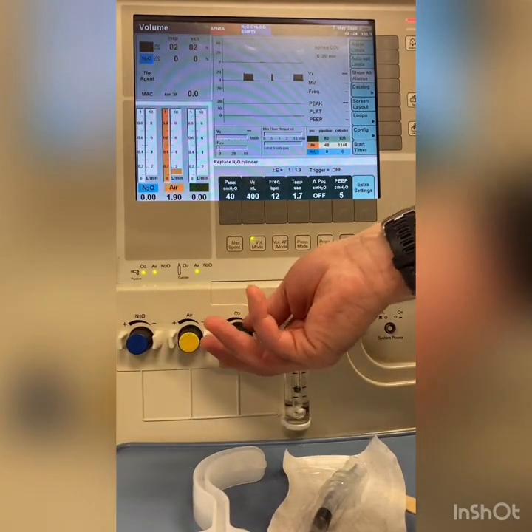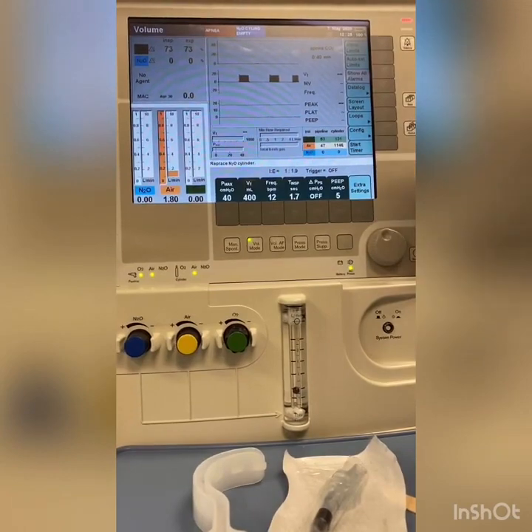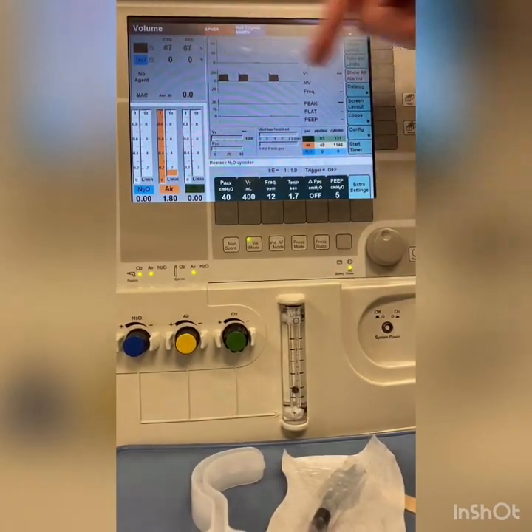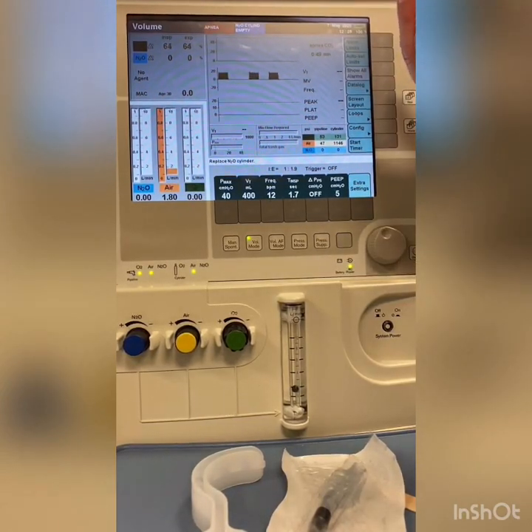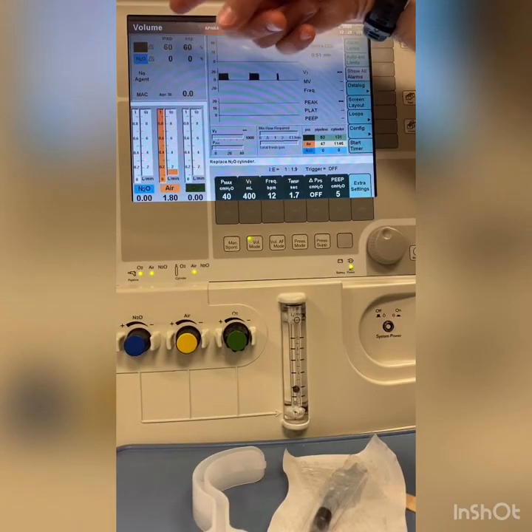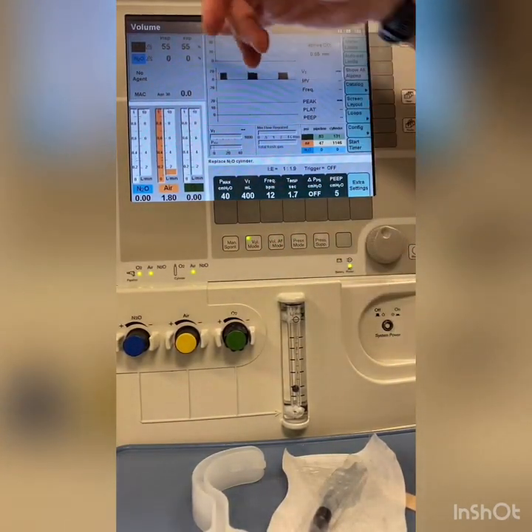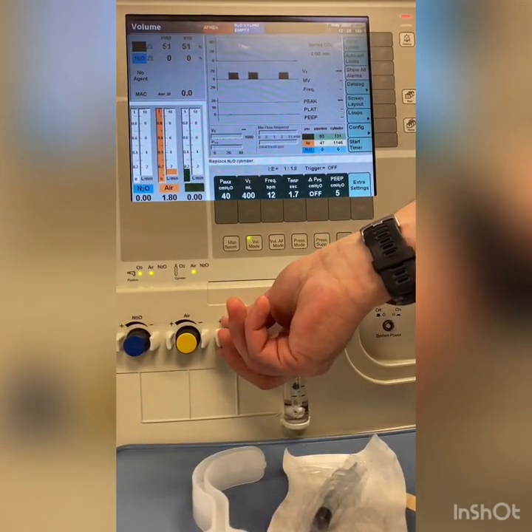Well, that's fine. I want you to remember 30% or less on oxygen delivery for inspired, unless the patient needs more, and that will be by the pulse ox. So 30% or less. Right now I'm giving 21%, so as ventilation goes, this will start dropping closer to 21%. If I need a little bit, I can always give a little bit.